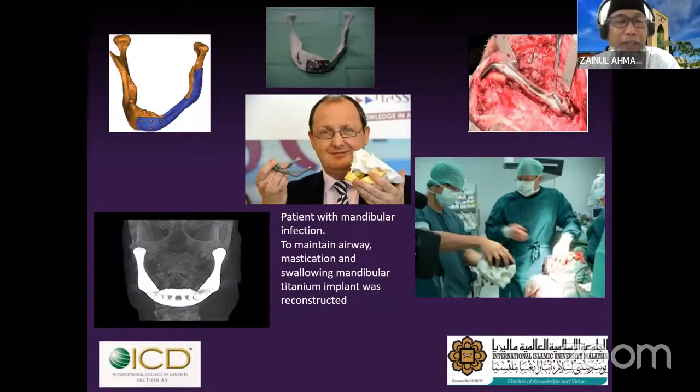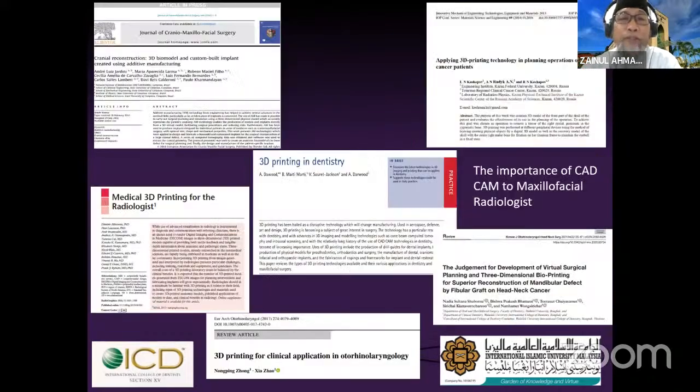Therefore, they reconstructed this mandible with titanium. They also brought it to the theater for discussion before they did the surgery. So this is another application of 3D printing, not only for preoperative procedures, but also to maintain the physiological functions of airway, mastication and swallowing.